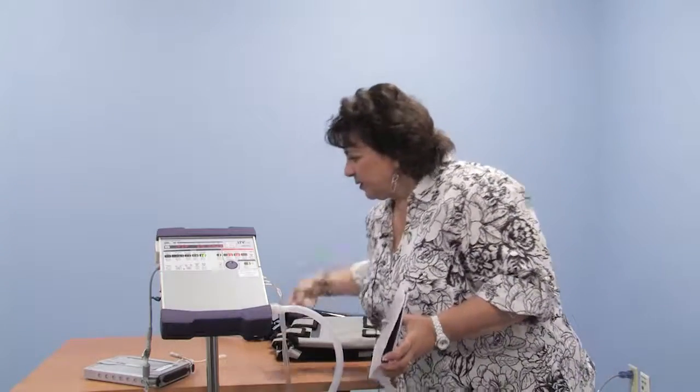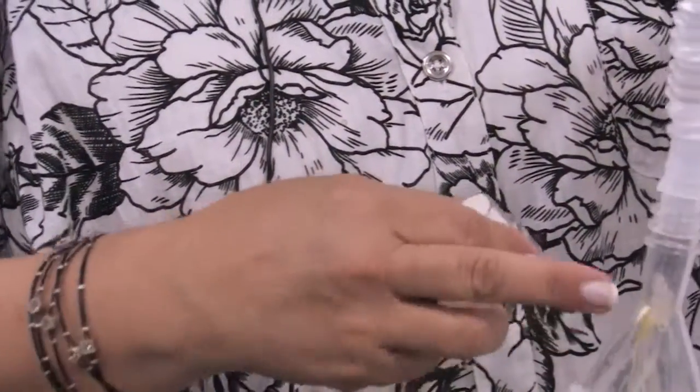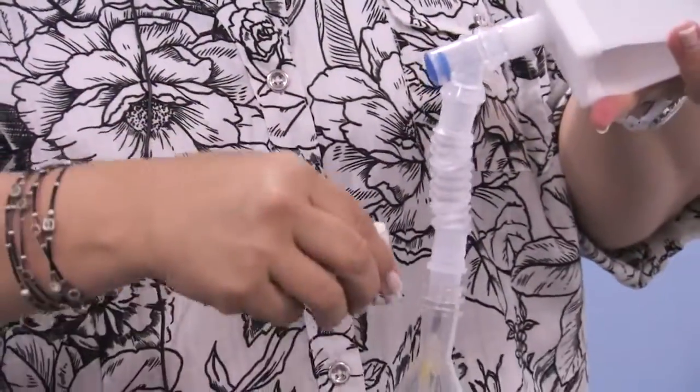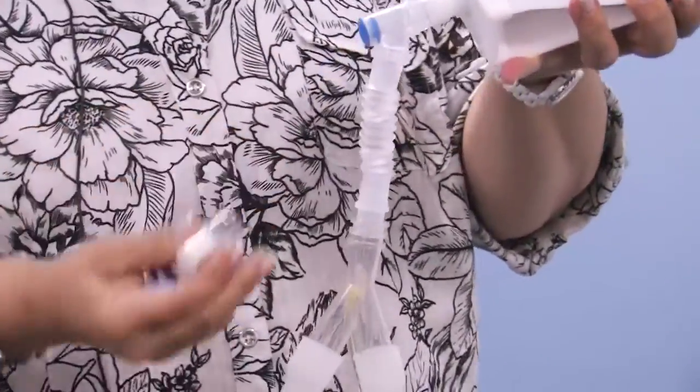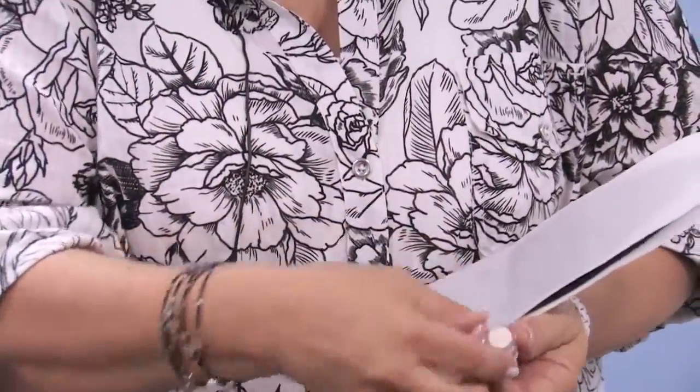When you're traveling, as we have this set up now with the dry circuit, it probably is advisable that you utilize an HME, the nose heat moisture exchanger. They come in many different sizes. This is a piece that will be placed between the ventilator and the trach adapter. And remember, this will add, again, more space between the fresh gas and your child's lungs. So we want to make sure it's appropriate size.